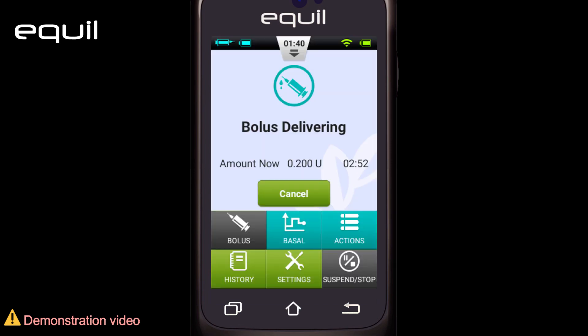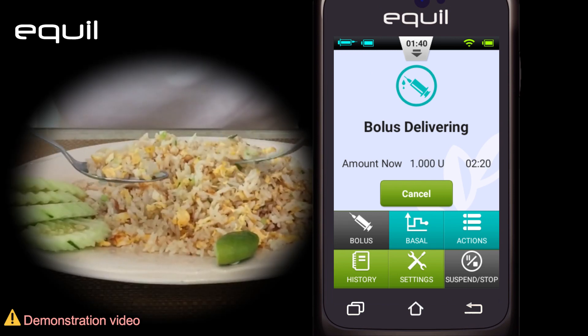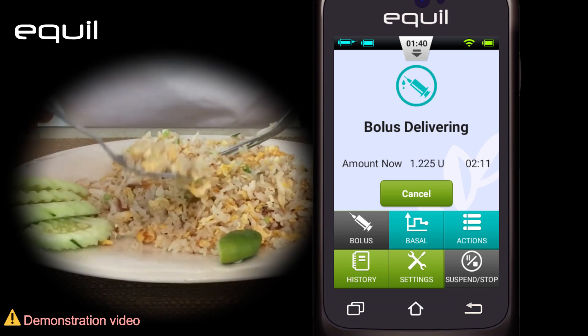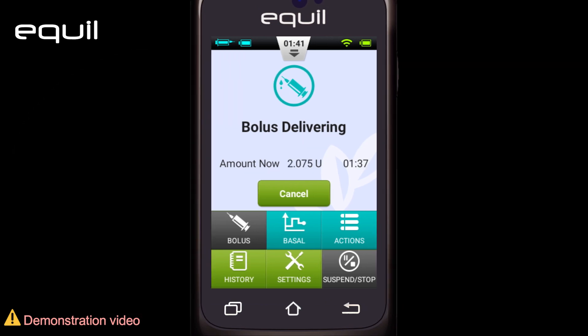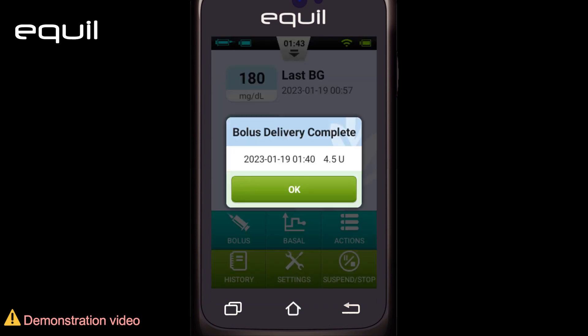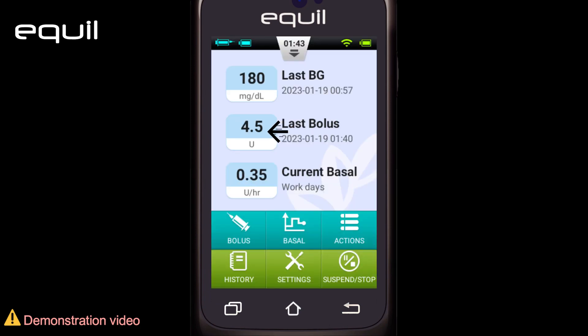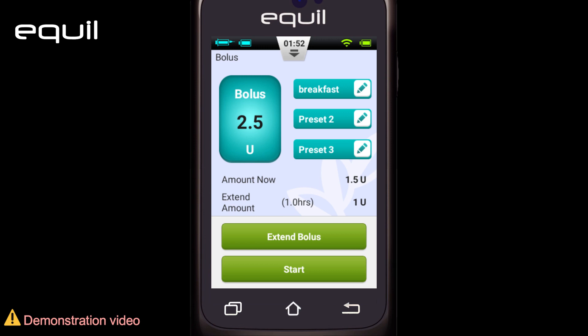In this way, we can control the amount of sugar from fast-digesting foods because the pump delivers the full dose amount right after starting it. However, we can use the extended bolus option for foods that take a long time to digest.